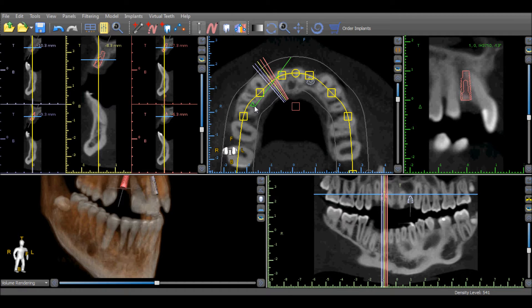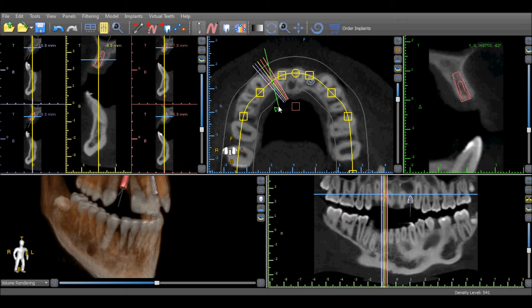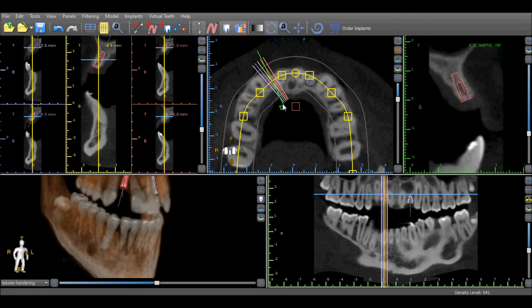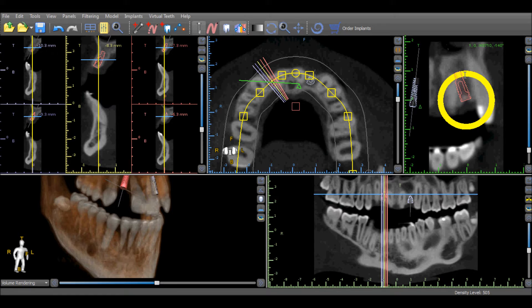The tangential view can be used to view the implant or element of the anatomy in any direction, whether it be mesial-distal, buccal-lingual, or any other angle. The little green arrow at the end of the indicator in the axial view corresponds to the little green arrow on the left side of the tangential view, indicating from which perspective the tangential view is being presented.